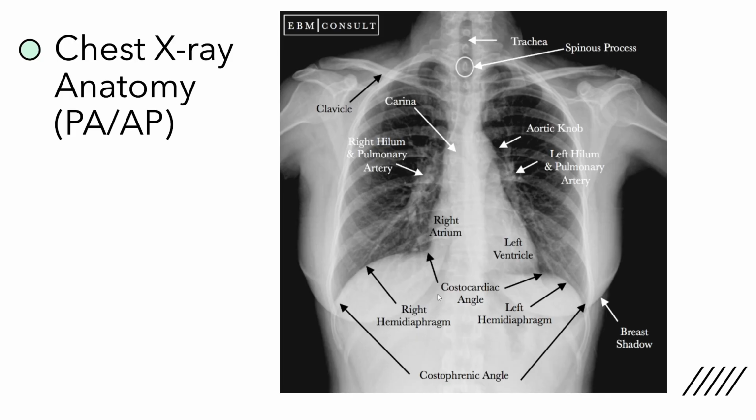When we're looking at the diaphragm, there is only one diaphragm, but we call them hemidiaphragms because we're looking at them on either side of the patient. It's important to look at them on either side because the left hemidiaphragm tends to be a little bit lower than the right, because we have this nice liver here that's bolstering up that right side. All right, so we have the right hemidiaphragm and the left hemidiaphragm.